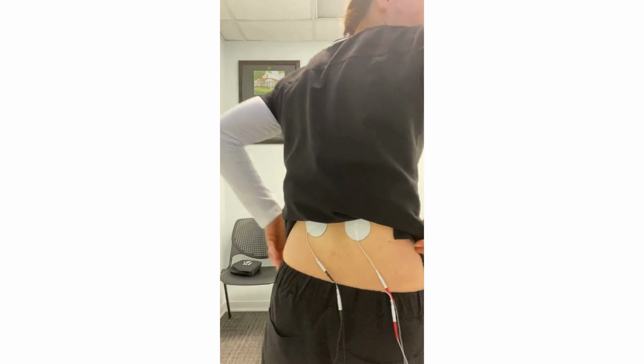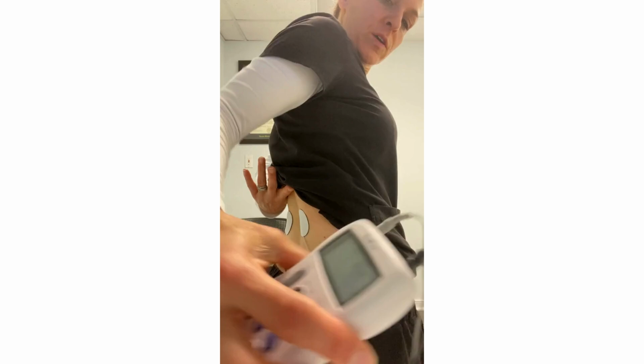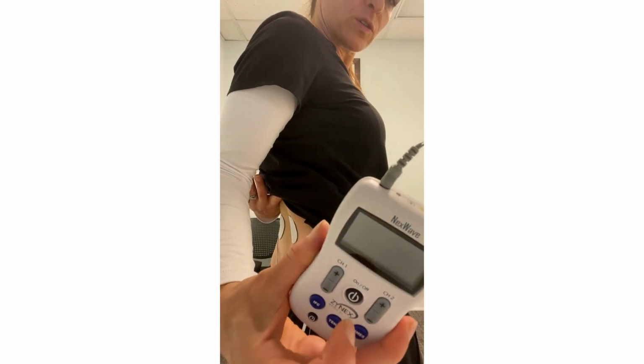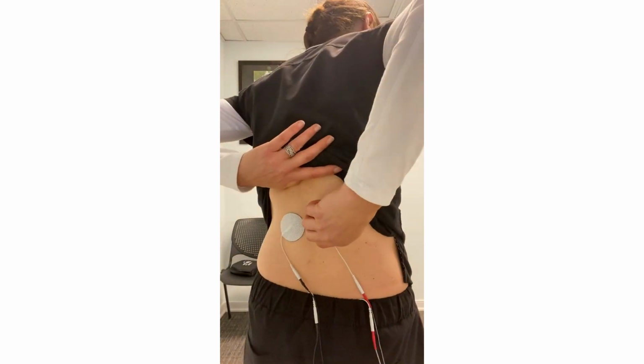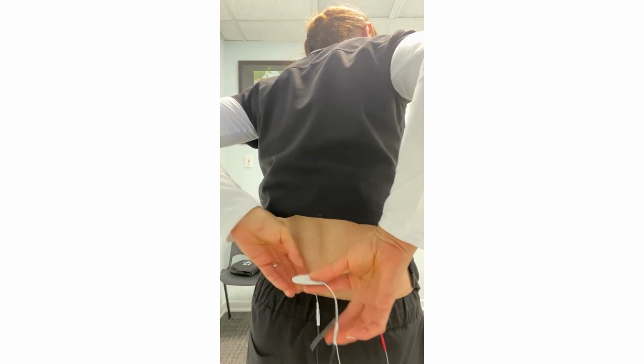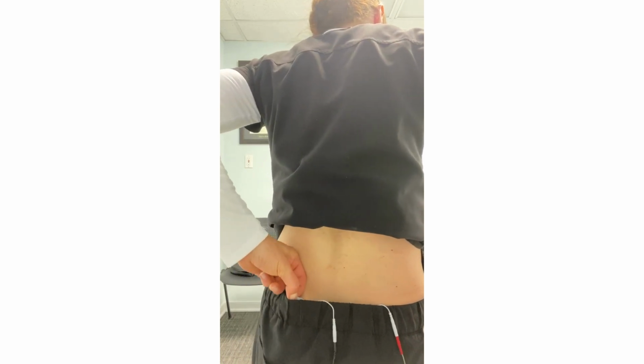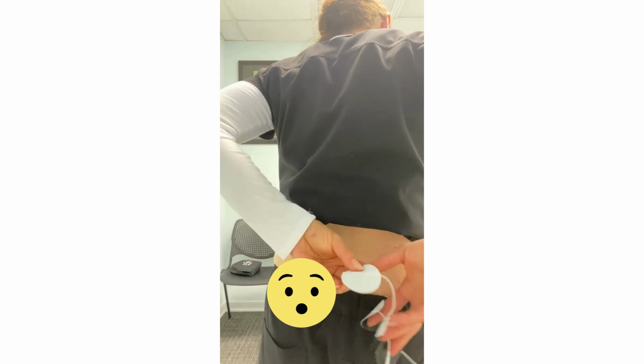To take the pads off, you're just going to make sure the machine is completely off. So turn the power off if you're uncertain, and then pull the pads by the pad, not by the leads, and replace them on your little sheet from NMES, or sorry, from Zynex.